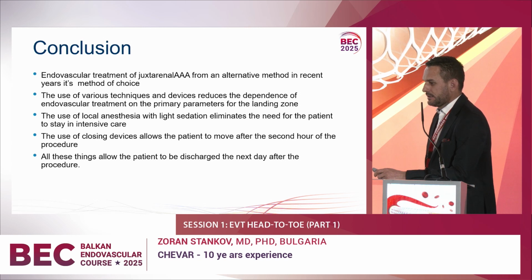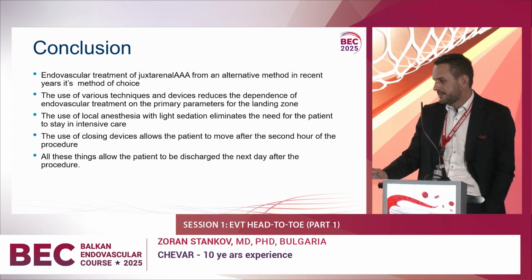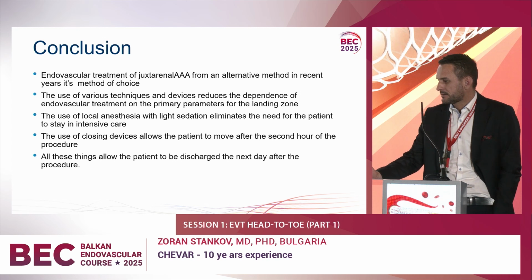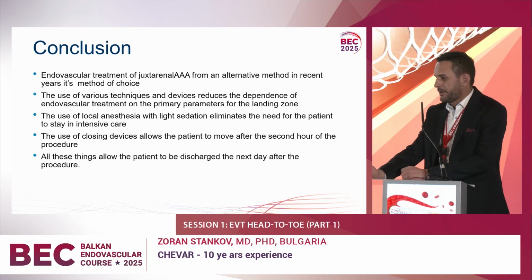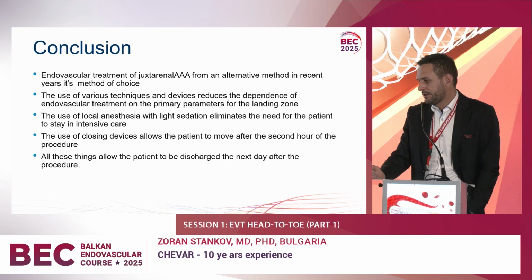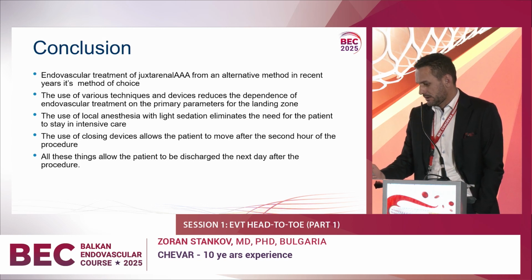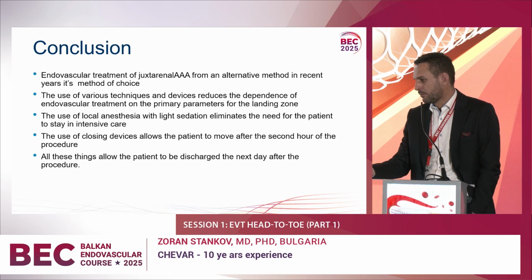To use various techniques and devices reduces the dependence of endovascular treatment on the primary parameter of the landing zone. To use local anesthesia with light sedation eliminates the need for the patient to stay in intensive care. The use of closing device allows the patient to move after the second hour of the procedure. This procedure is safe for the patient, and we can use it in the group of patients when needed. Thank you.